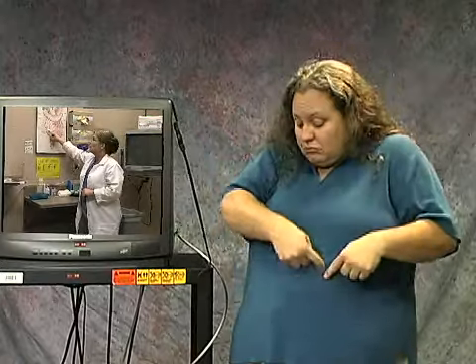As he's doing this, and he's turning some of the corners in the colon, there's a sensation of fullness and sometimes some cramping. They feel like gas cramps. They don't last very long. They can be intense, but they usually last a matter of seconds. When the doctor gets to the end of the colon, those feelings go away, and this is when they really get the good look. As he comes out of the colon, he'll be using the scope. Again, the end is articulated. The doctor will look at every inch of the colon, and it's actually a visualization of the inside.